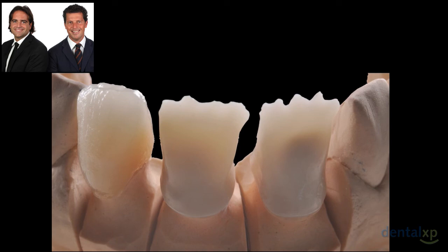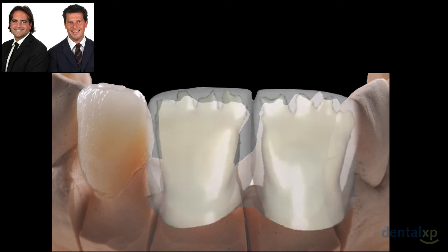You can see the stone abutment that is visible under the framework. As I was saying before, this is exactly what he planned two minutes ago in the software.